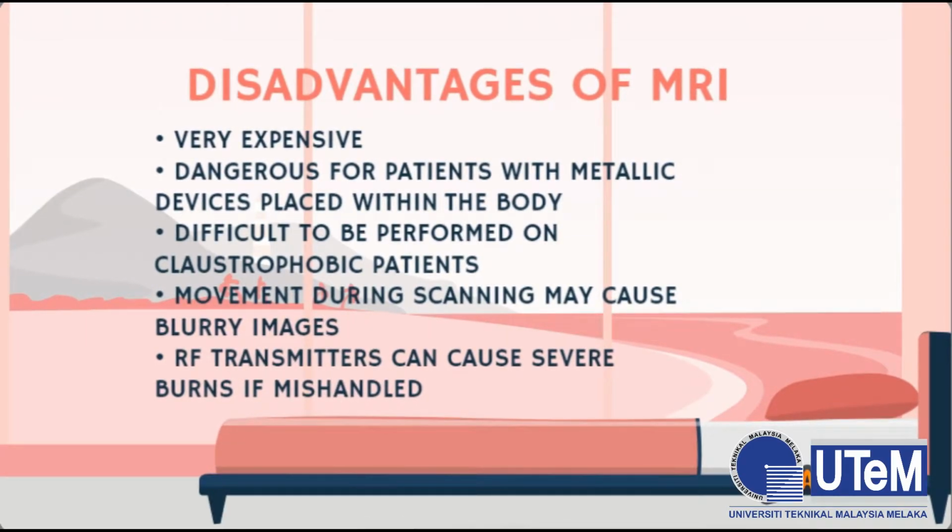Disadvantages of MRI: it is very expensive. It is dangerous for patients with metallic devices placed within the body. It is difficult to perform on claustrophobic patients. Movement during scanning may cause blurry images. RF transmitters can cause severe burns if mishandled.